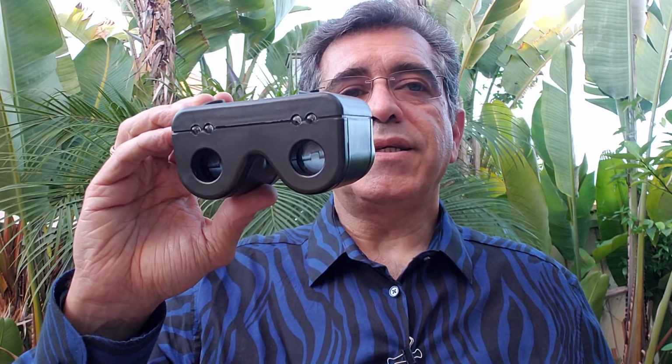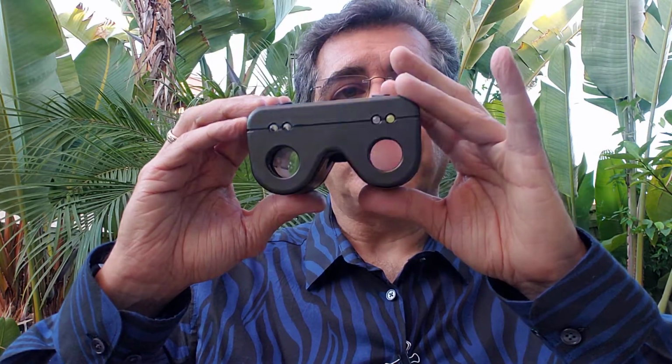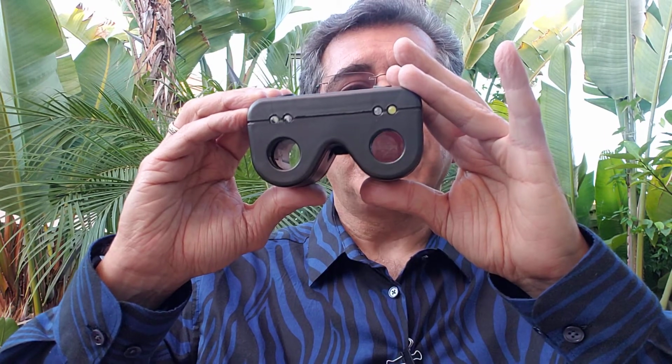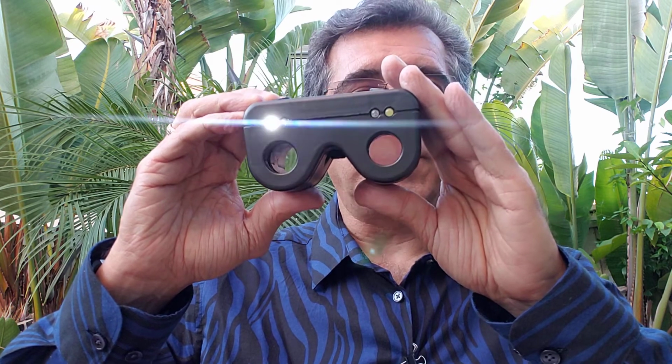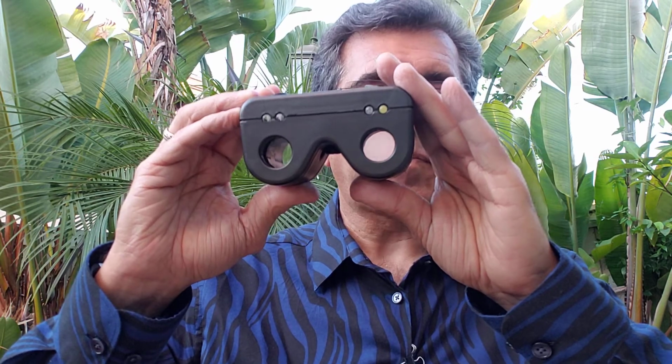So you can repeat this test a couple of times, each time letting the pupil get back to its rest state for a second or two. Then you can shine the other pupil and look for the direct response and consensual reactions. Once you have determined that each pupil reacts normally to direct light and consensual light, then you can start testing for relative afferent pupillary defect, or APD.